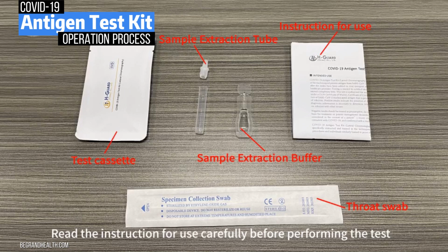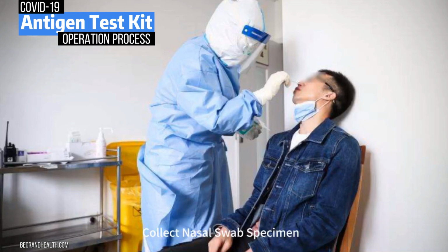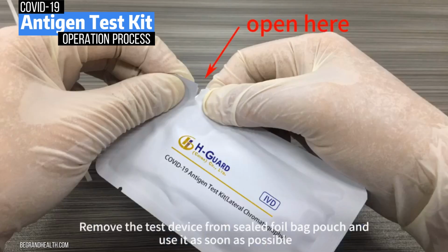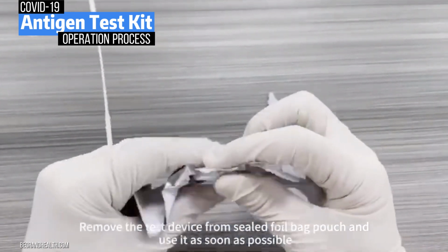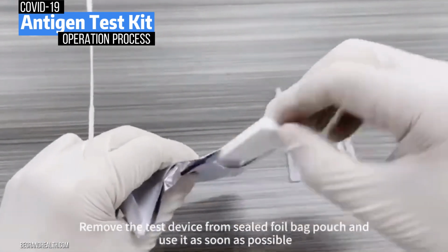Read the instruction for use carefully before performing the test. Collect nasal swab specimen. Remove the test device from sealed foil bag pouch and use it as soon as possible.